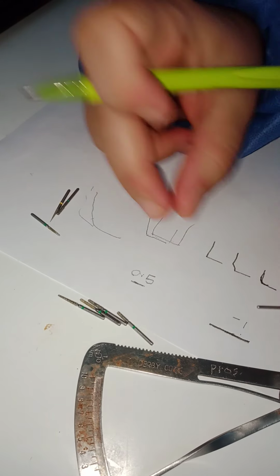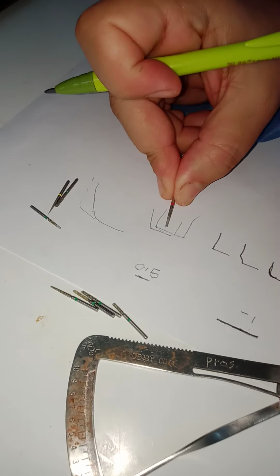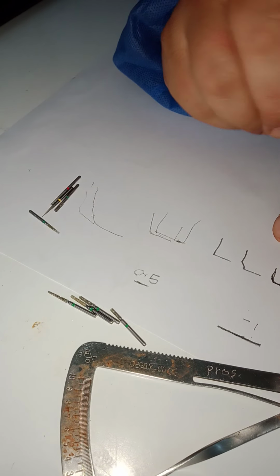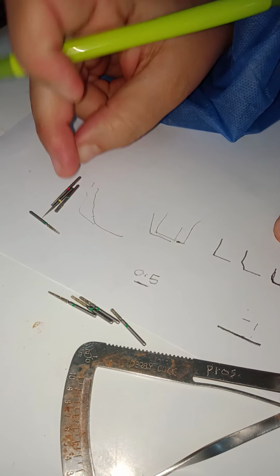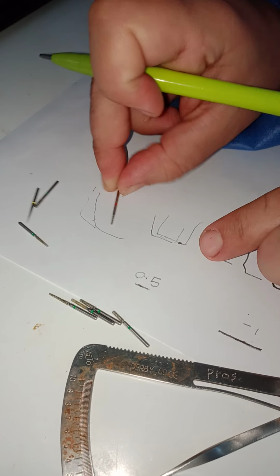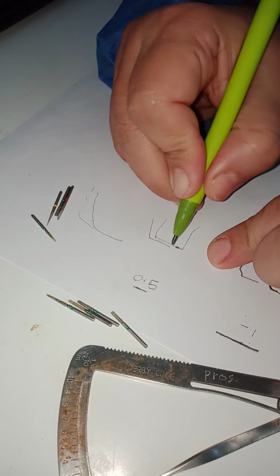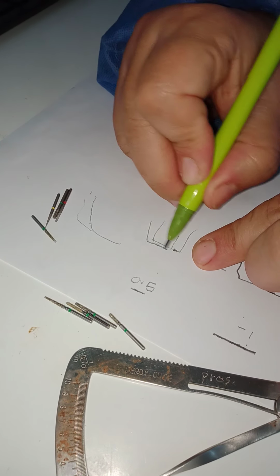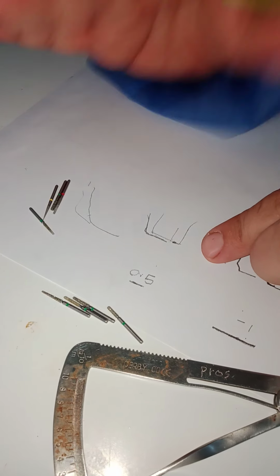So I've done this initial preparation with a bur that's gauged 0.8, for example, and I leave part of the bur outside. And then when I come to finish, I bring the yellow bur also with the same taper, and it's 0.5 at the end, and I polish and make sure that my minimal preparation, 0.5 preparation, is smooth as well. Okay, so this is how we create.